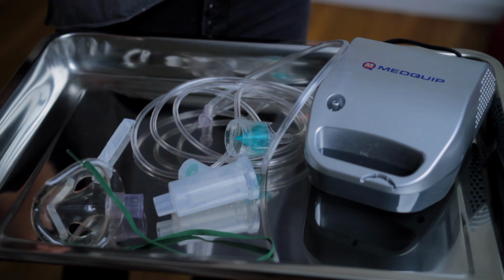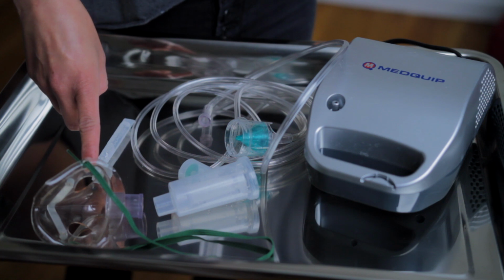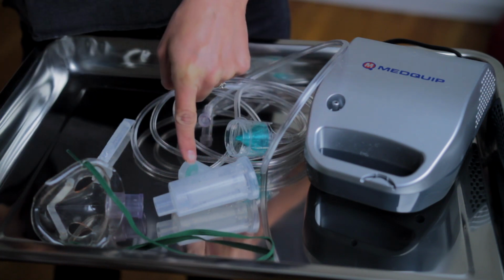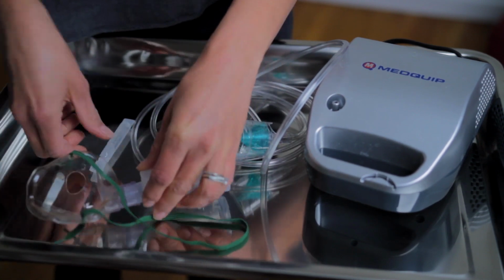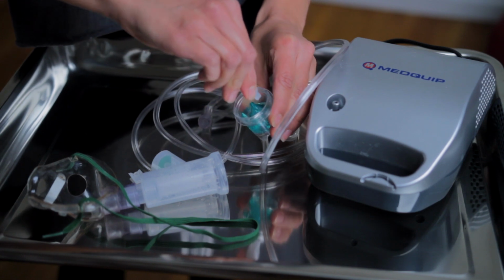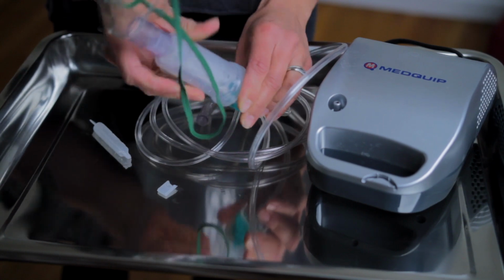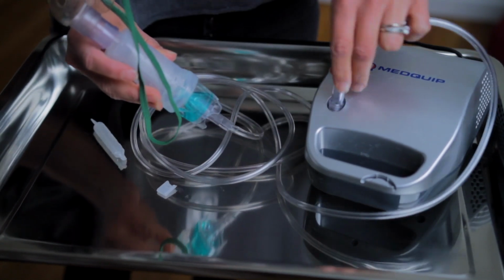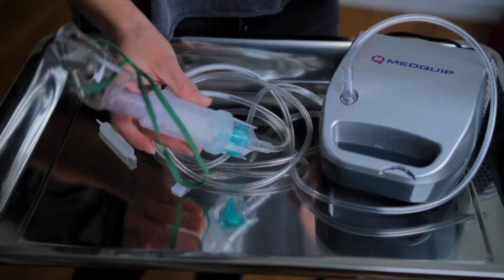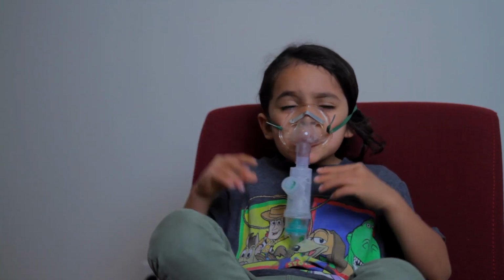These are the parts of the nebulizer. This includes your mouthpiece or face mask for single use only. This can also be attached to a patient's trach, so the mouthpiece, which is attached to the nebulizer that attaches to the medicine cup where you will dispense your medication inside, which is liquid form with a volume size of about 3 ml. Make sure you secure the device closed, which will attach to the hose or tubing that will connect to your machine, also known as the compressor. You can then apply this to your patient for administration.